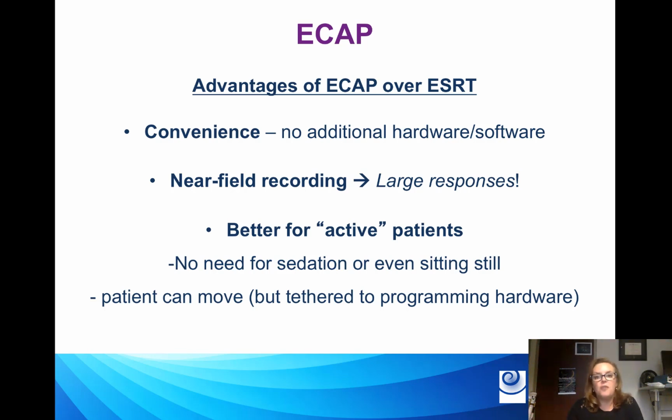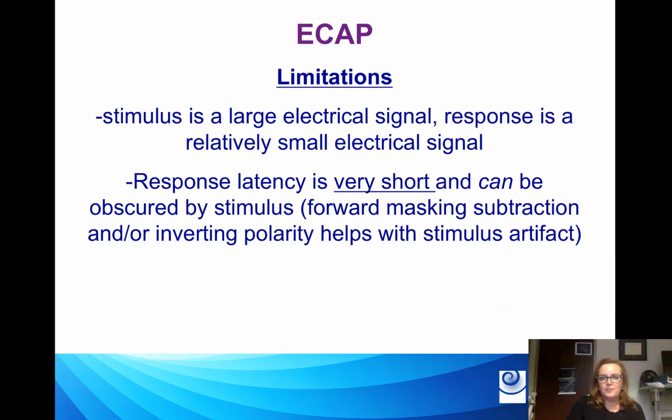And for those of you who've already used it, you know that the patient can be kind of moving around, especially little kids, they can be kind of playing with things, and you can still measure it just beautifully. No sedation needed, and they don't have to necessarily be sitting super still. Of course, they are still tethered to the programming hardware.